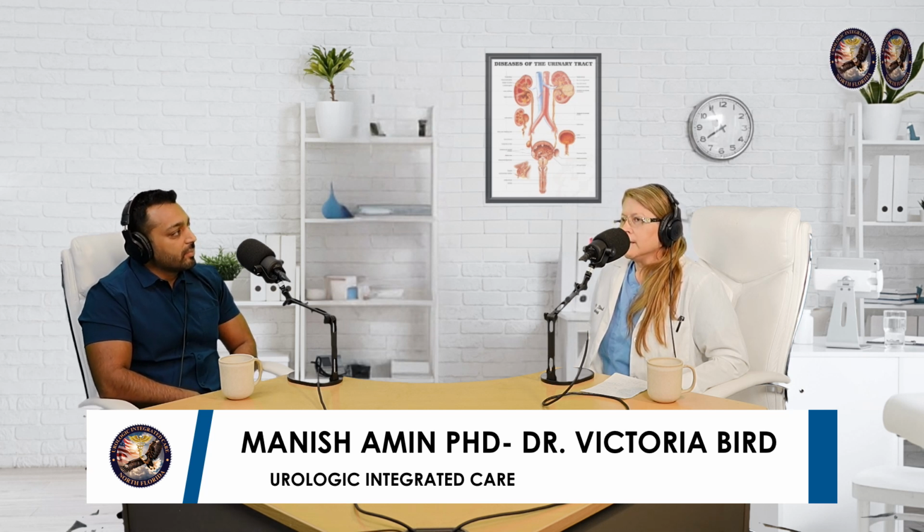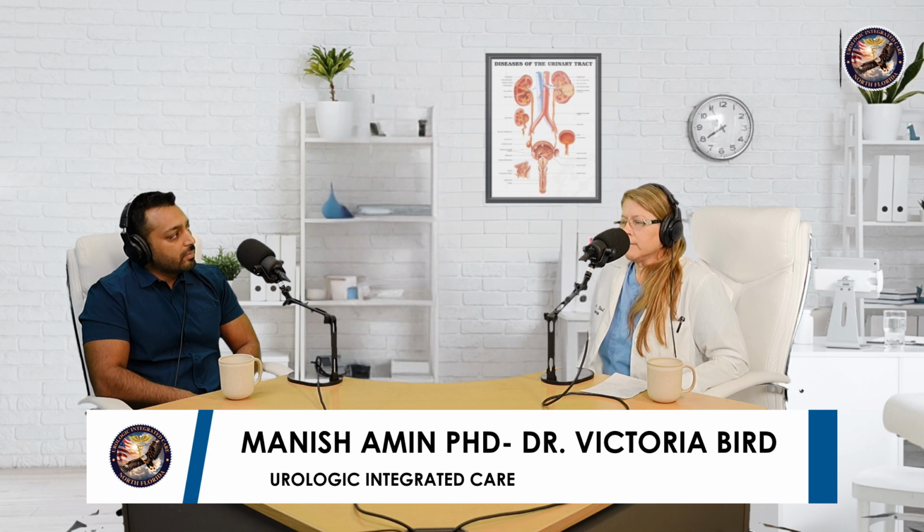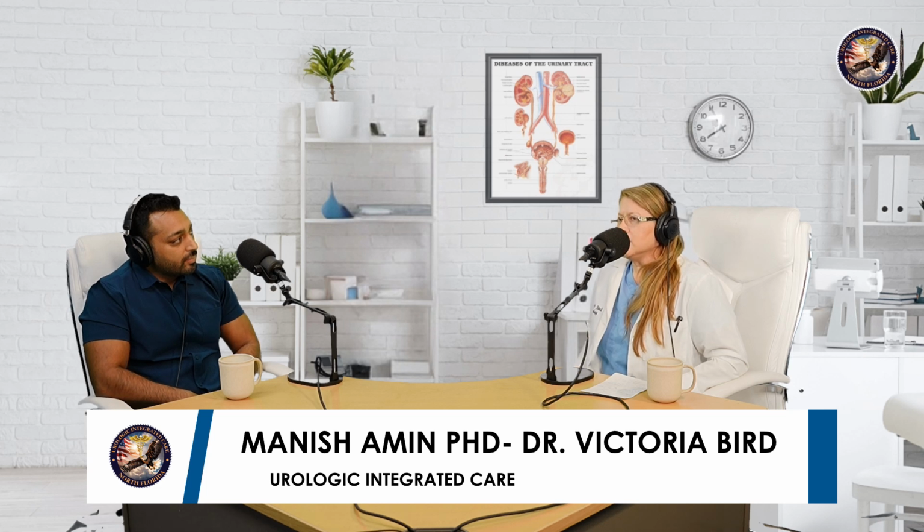Actually, he's considered one of the best prostate radiologists in the field, and he showed me about the ADC values. Then I did some research on it, including IRB-approved research through our company, where we looked at all of our patients' ADC values. We found that using a 1.5 Tesla Siemens scanner and a 3 Tesla GE scanner, even though they were completely different scanners, the ADC values still hold for certain grades of tumors, 6, 7, 8, 9, and 10.